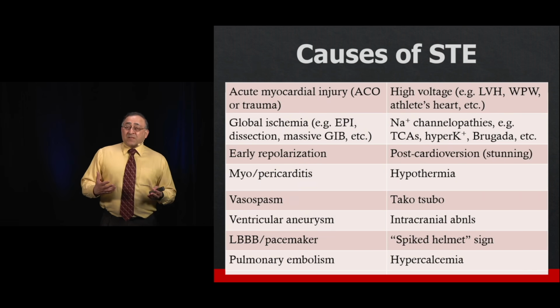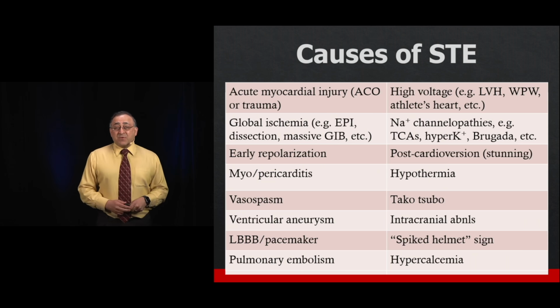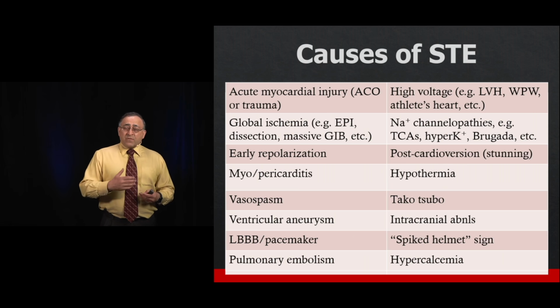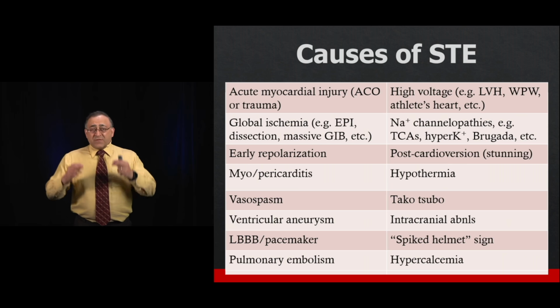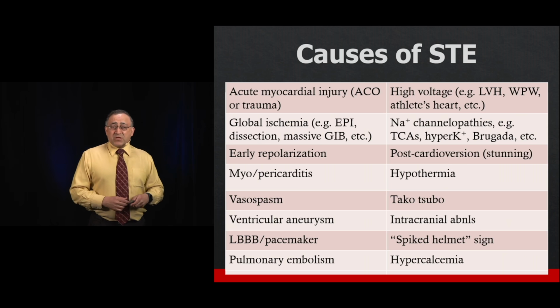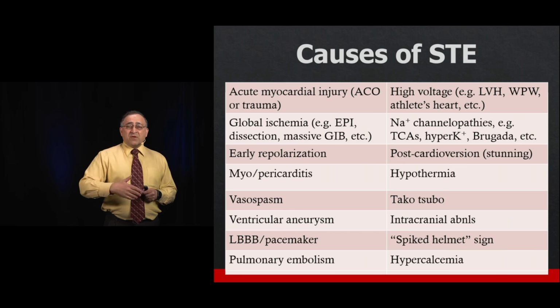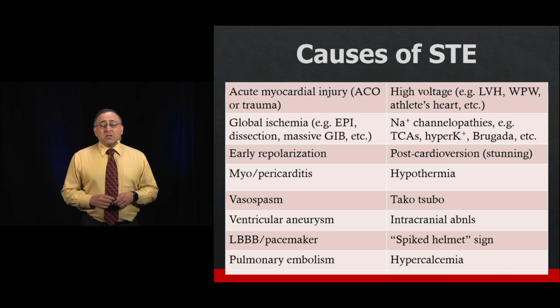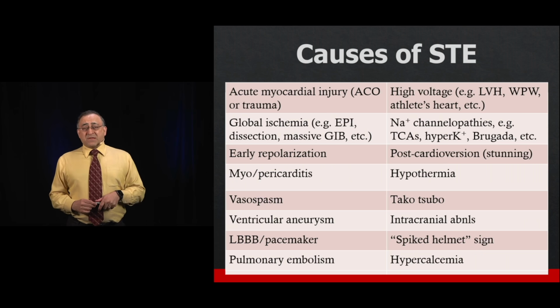Part of the problem here is that there's really a lot of things that can produce ST elevation, and I don't think most people learn this. I certainly didn't learn it when I was in residency, and over the course of many years, I've gradually learned about all of the different things that can produce ST elevation. You can look through this entire list. You're not going to commit this to memory, but it's important to understand that there are a lot of other things that can produce ST segment elevation.